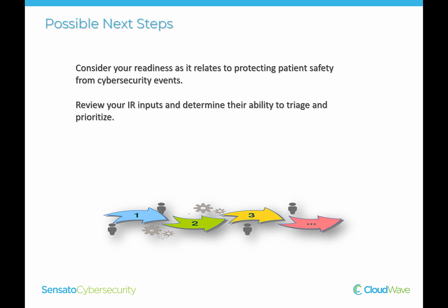One way, and it's sad that we have to talk about this, but you have to understand that if a situation with a patient occurred and there's a civil suit, you could get deposed and have to discuss all this, right? The question's going to be, what do you mean the nurse on 3 West called the help desk, but the help desk took 15 minutes because they had to call their supervisor, and it's 3 o'clock in the morning and they were on call, but they couldn't get a hold of them?